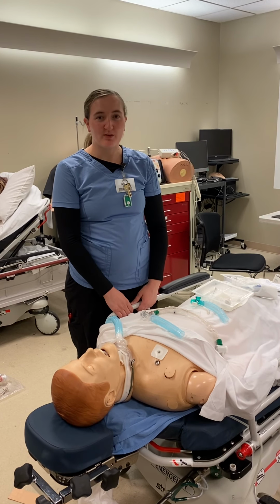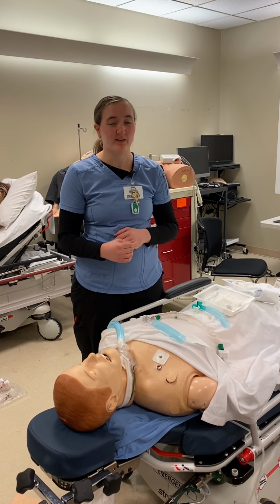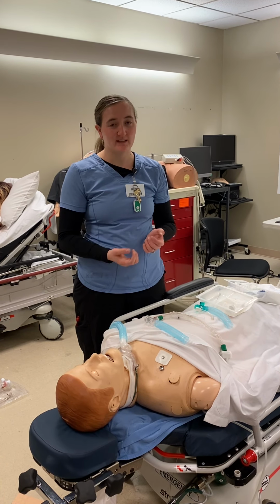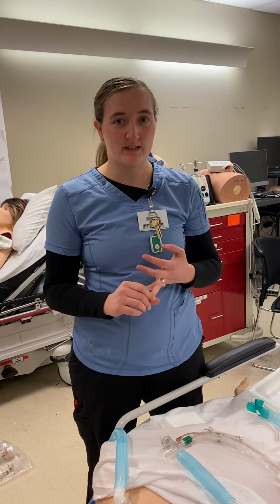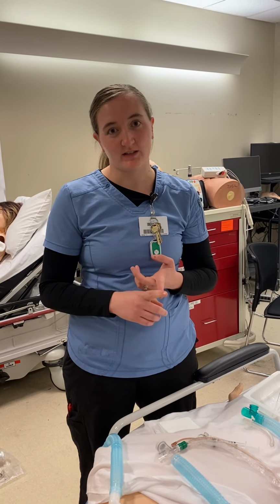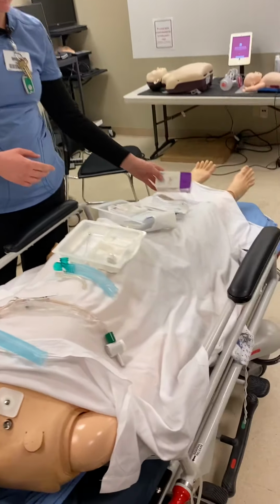Hey team, we're going to go through some trach care today on patients. Remember that this should be documented and done every 8 hours on your shift. The ideal times would be with your 6 a.m. assessment, your 2 p.m. reassessment or cares, and then your 10 o'clock at night. So it gets done at least 3 times a day.